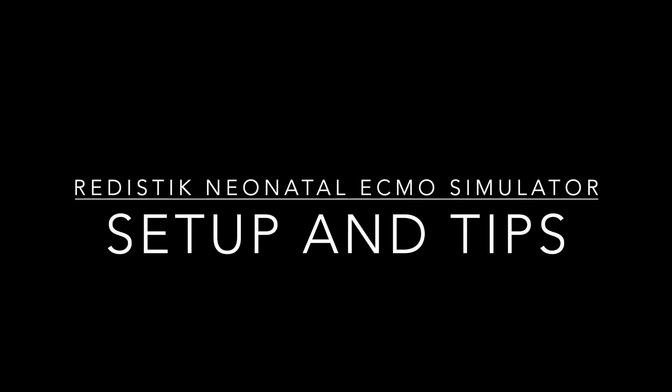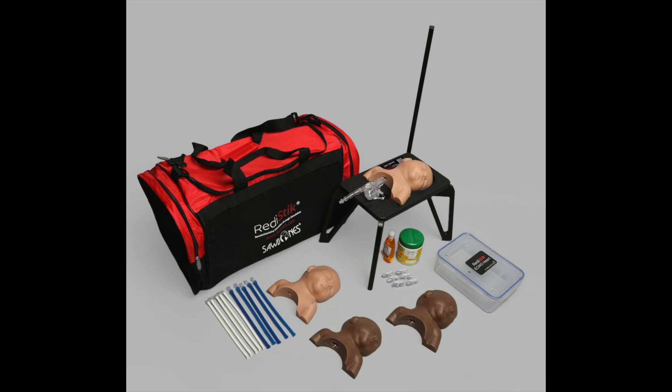In this video, we're going to go over what is included in the ReadyStick Neonatal ECMO Trainer Kit and tips and tricks for setup.